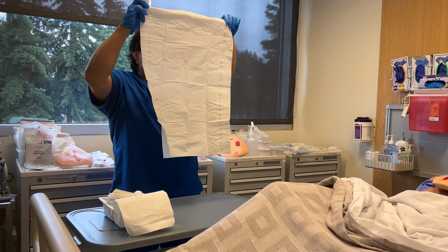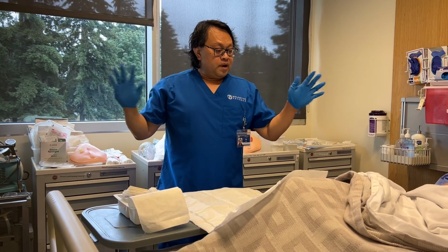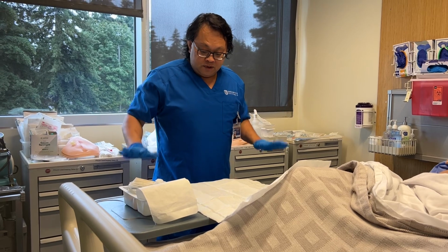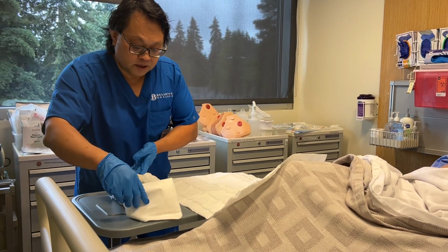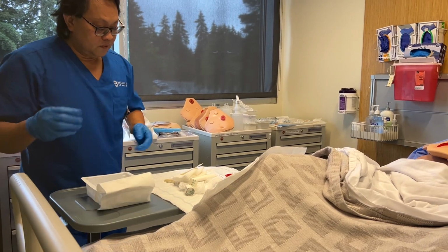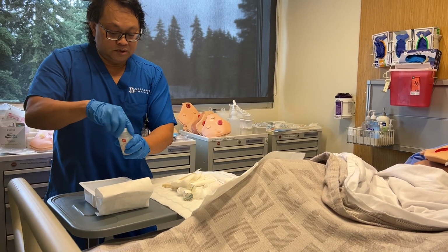All right, I'm going to set my sterile field. The whole time I'm making sure that I am not turning my back towards the patient, for sterile field integrity. I am not putting my arms or hands underneath the sterile field. Okay, and now I'm going to dump my contents without touching anything. Okay, I'm going to set this down. I am going to dump my solution out.